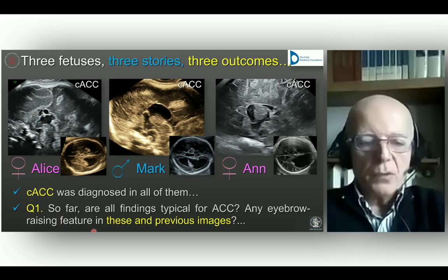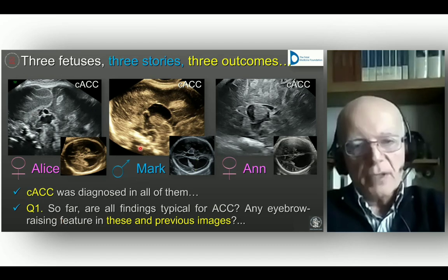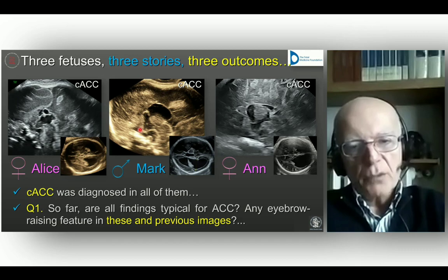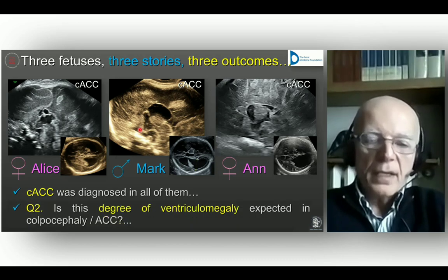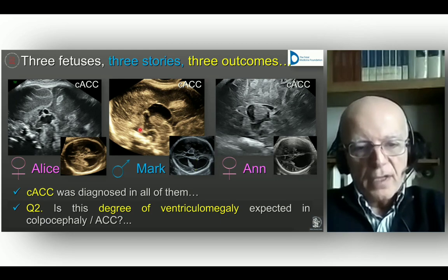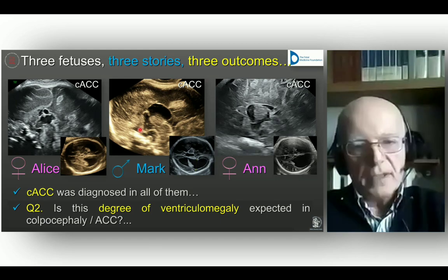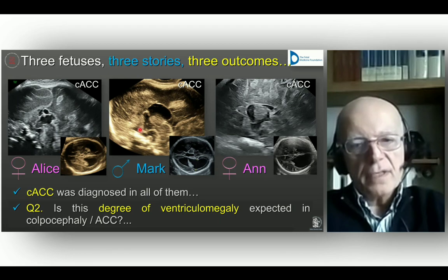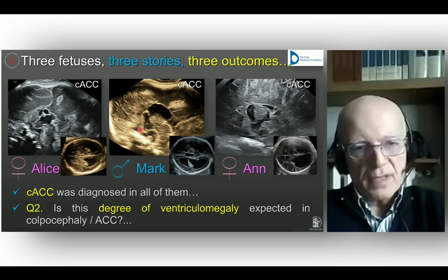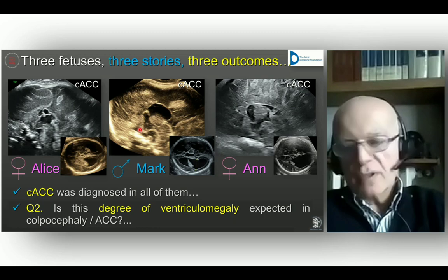Write any comments in the chat and we'll discuss it. The question is: is this degree of ventriculomegaly exceeding 15 to 20 millimeters in all of them typical for ACC in the third trimester, or do you think it is too much as a colpocephalic aspect? Now we follow the stories of the three babies.